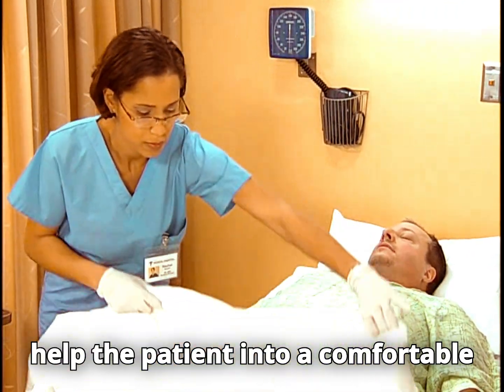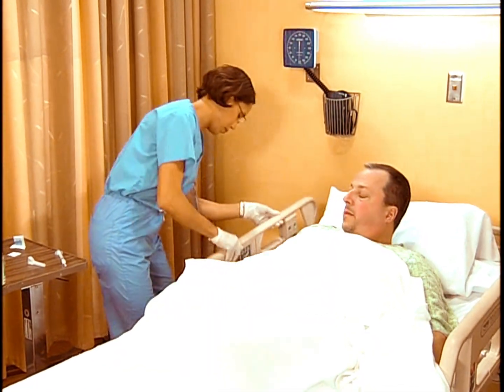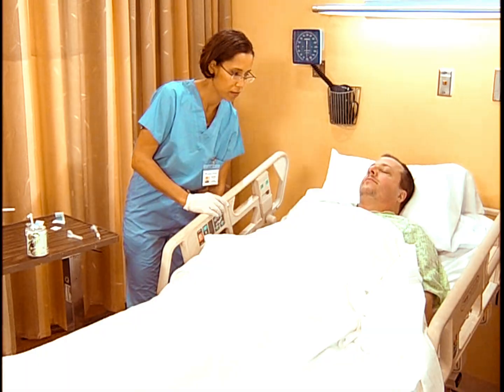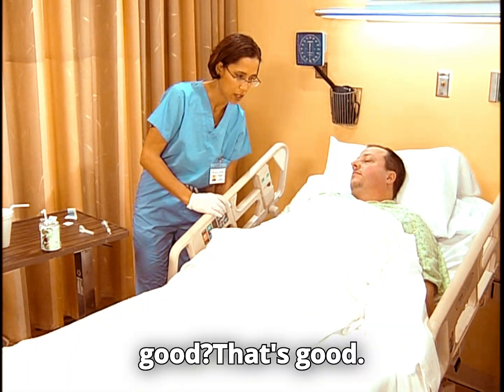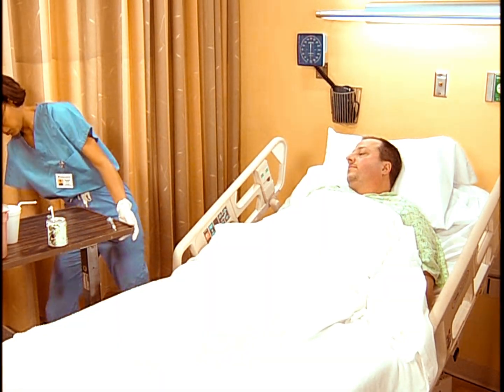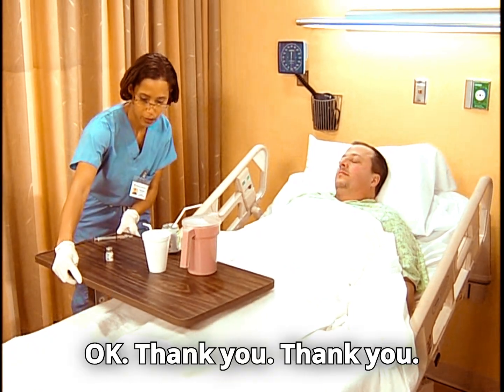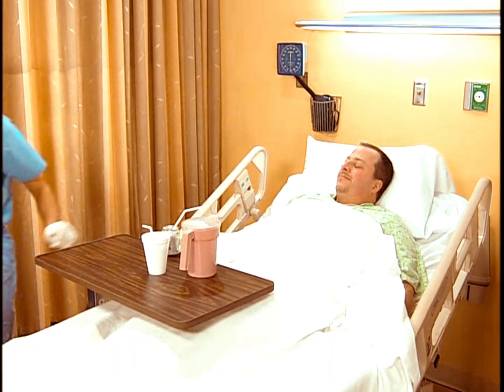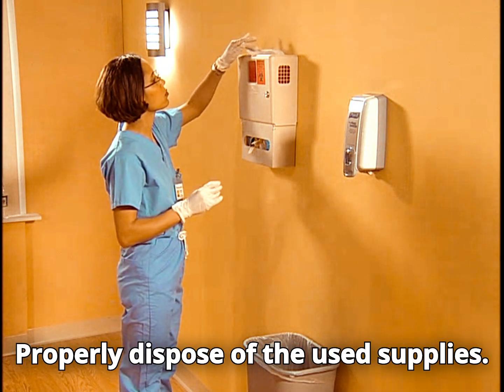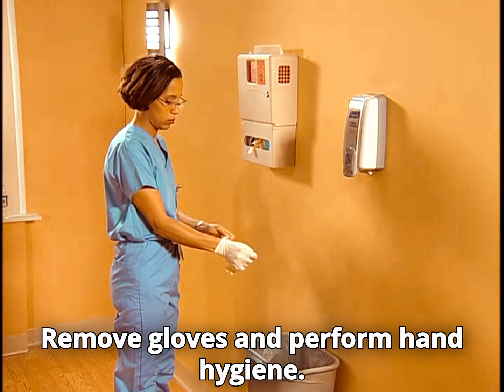Now help the patient into a comfortable position. Properly dispose of the used supplies. Remove gloves and perform hand hygiene.